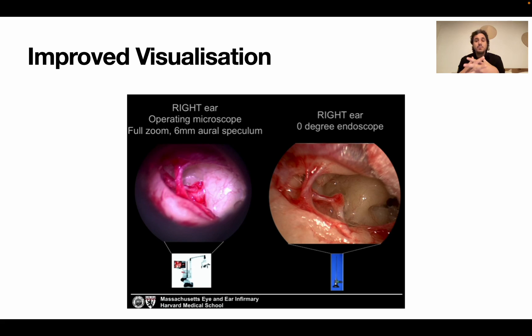This is one of the most iconic images - a presentation from Danny Lee showing the same ear viewed with an endoscope and with a microscope. You can see the difference clearly. This example shows a long process necrosis of the incus. The images speak for themselves. Improved visualization is the most important reason for switching to endoscopic surgery.